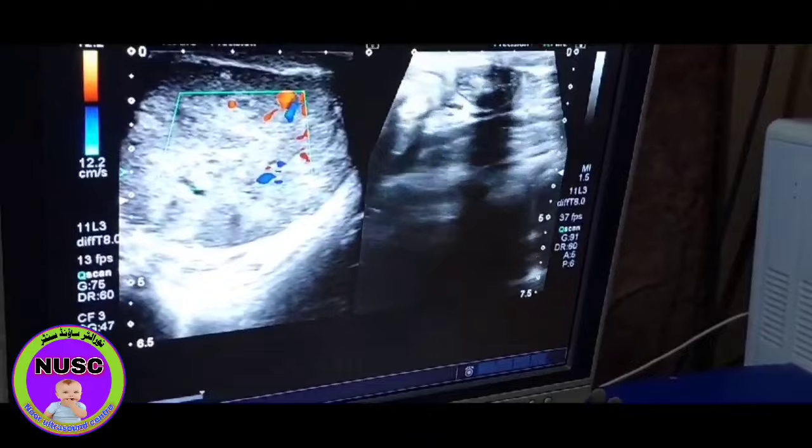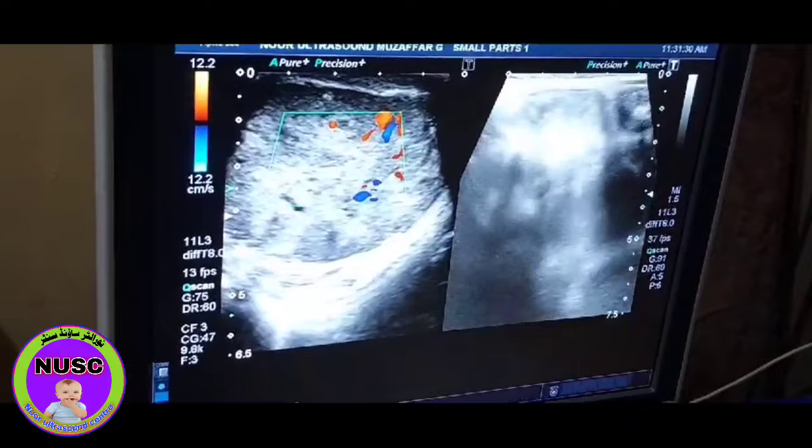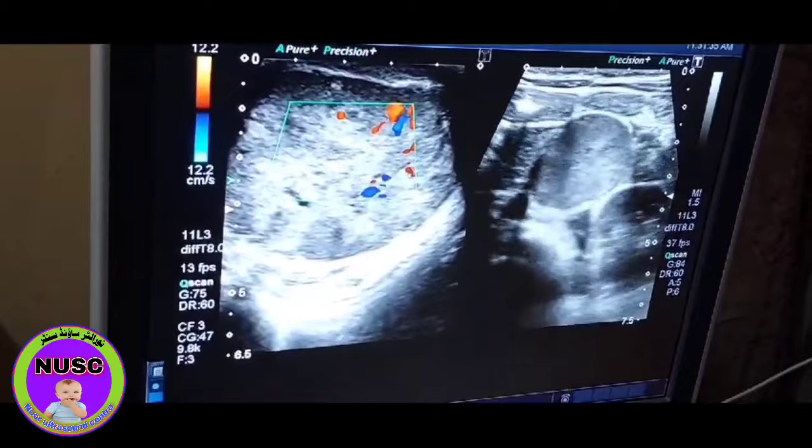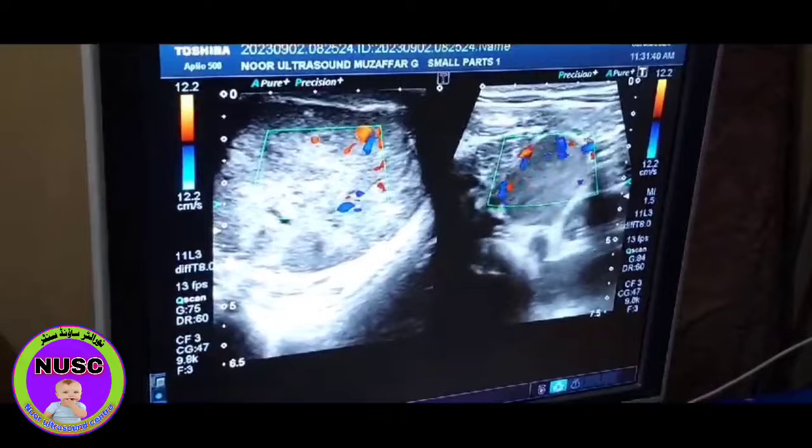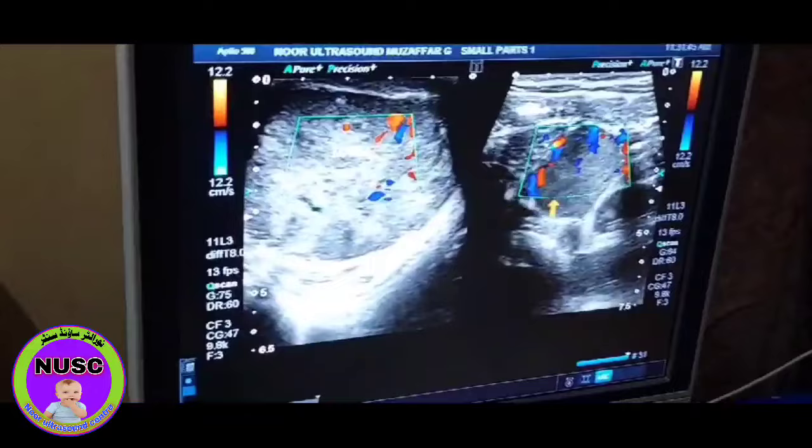This is the aorta and this is the lymph node, which is also vascular.